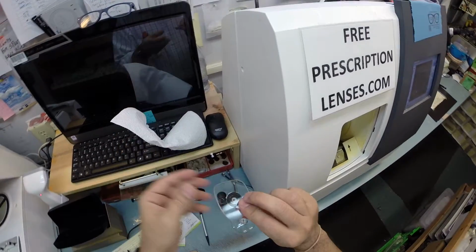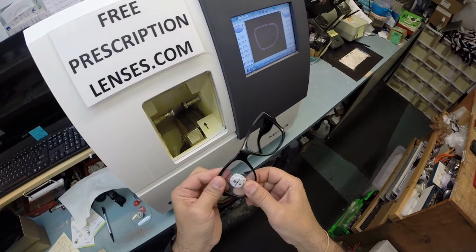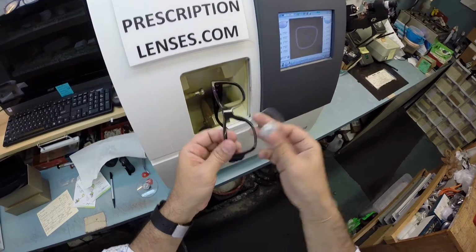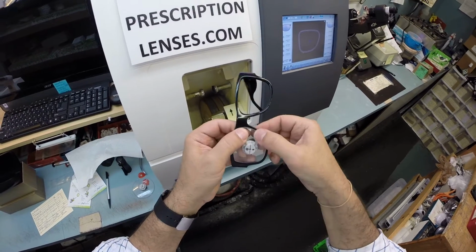So I just want to dry the lens off so it's no longer slippery. I'm going to tuck this lens in at the outside corner. Then using my thumbs, I have the empty side closest to me. And I start by tucking the outside edge in first, and then use my thumbs. I press down at the nose, it snaps right in.